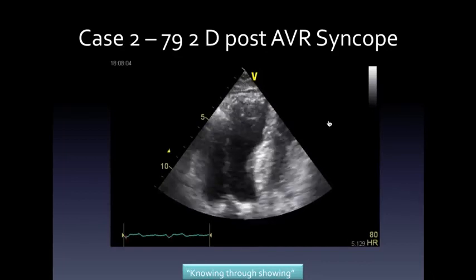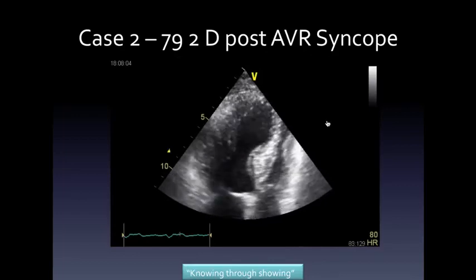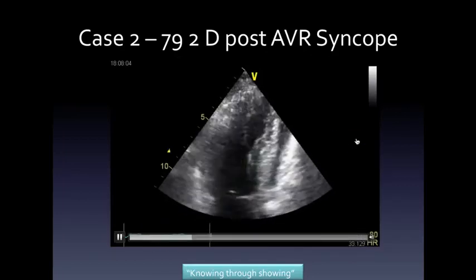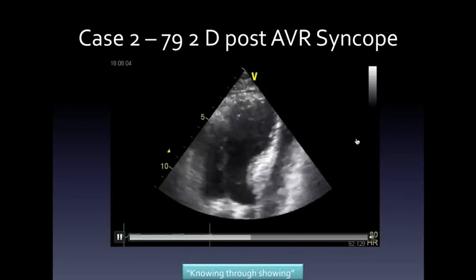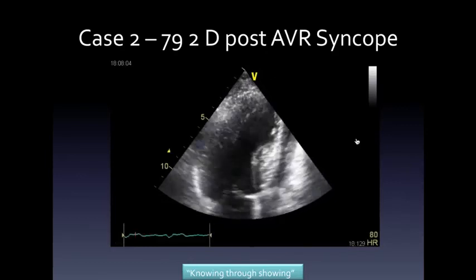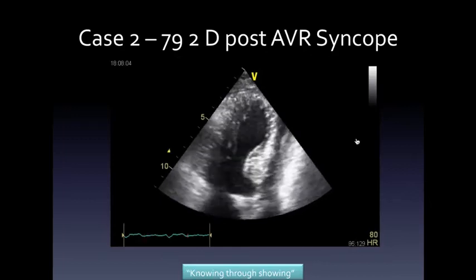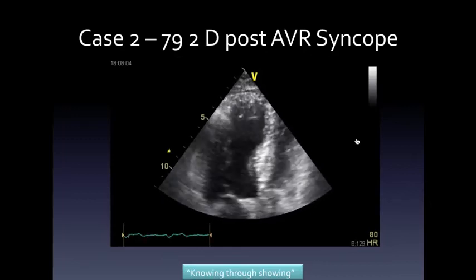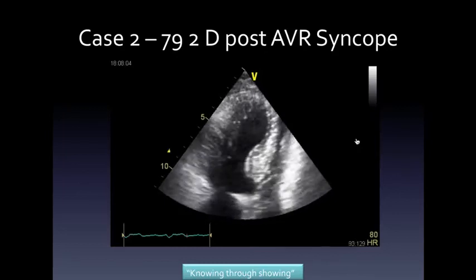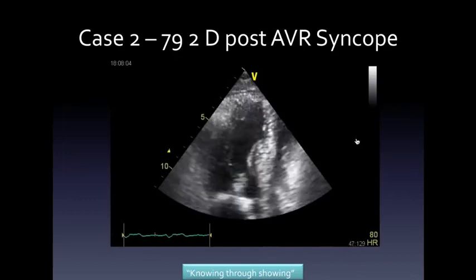He also, as you correctly said, has an interventricular conduction delay, but you get a hint on his ECG. See his ECG down there? It shows a wide QRS. So he's got distal septal dyssynergy, okay? You can't tell just from the ECG, because we don't know what lead it is, whether that's left bundle branch block or right bundle branch block, or non-specific interventricular conduction delay. Or, if he's post-surgery, he still might have his pacing wires in, so it could be paced rhythm. All you can say is that he's got a dyssynergy. That's all you can really say.